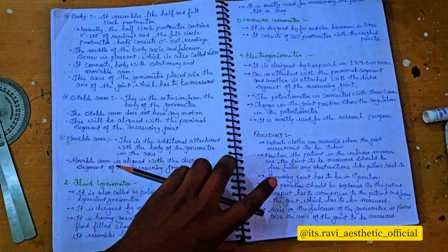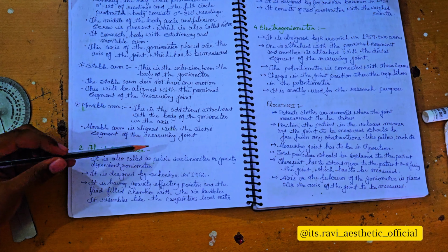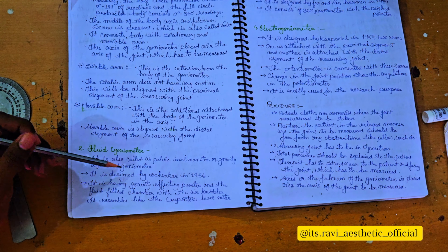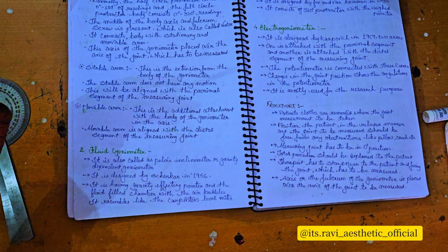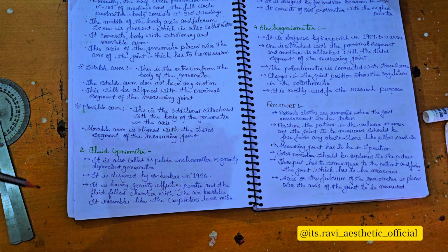So next is our fluid goniometer. It is also called a pelvic inclinometer or gravity dependent goniometer. So basically it is a fluid goniometer, pendulum like, so it can be used to measure under water. So what exactly is the range of motion happening in the fluid goniometer? It is not widely used and accepted.